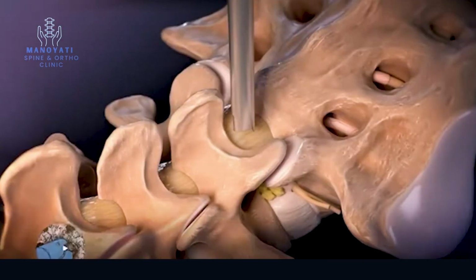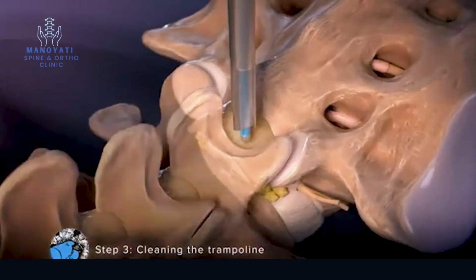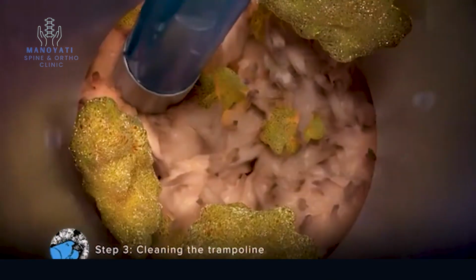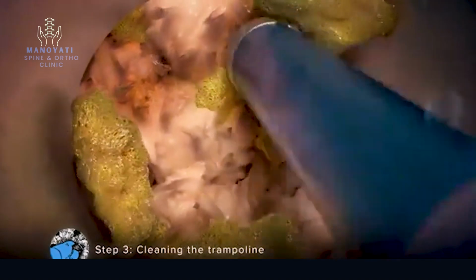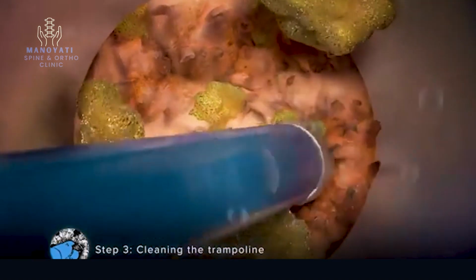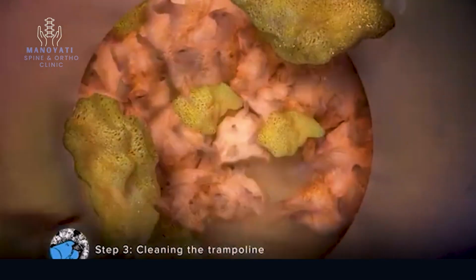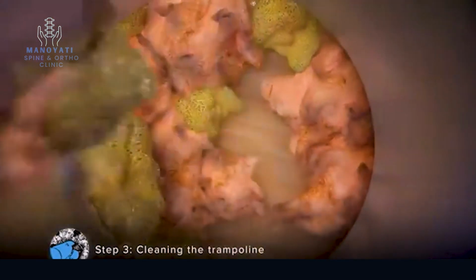Step 3. Cleaning the trampoline. Once the endoscope has been inserted, insert a series of grasping instruments and the electrosurgery probe through the working channel of the endoscope to remove excess tissue and coagulate blood vessels to expose the ligamentum flavum.